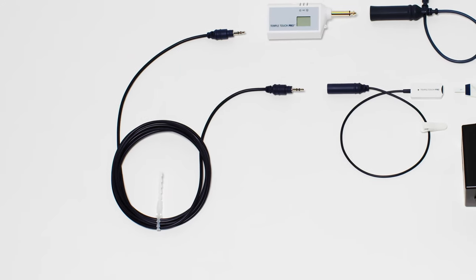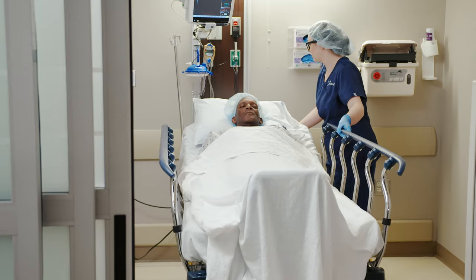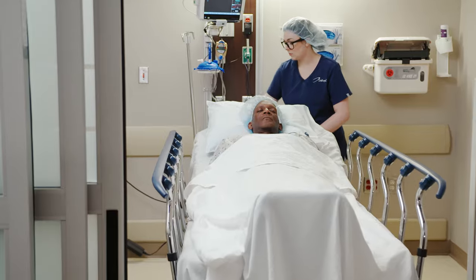The two-part breakaway cable design allows the sensor assembly to easily disconnect from the monitor, allowing simple transfer of the patient between units or for the patient to get out of bed.